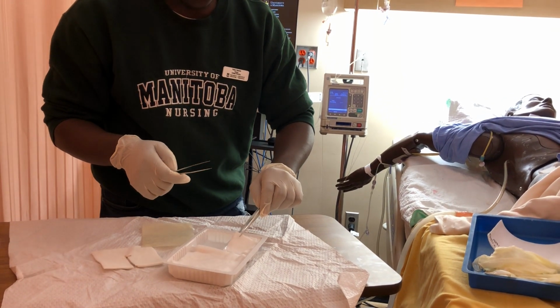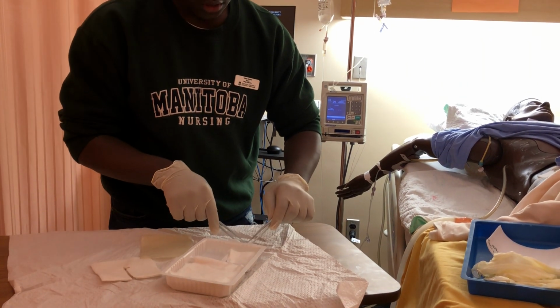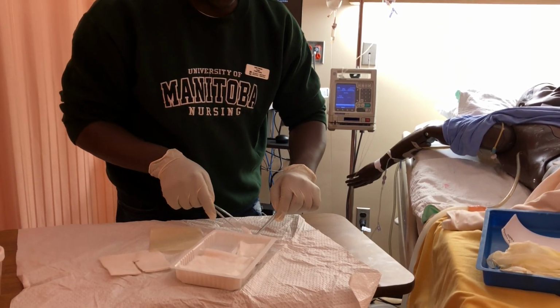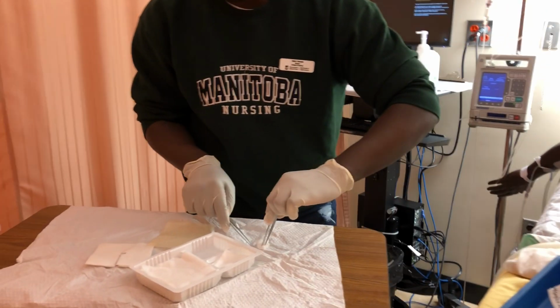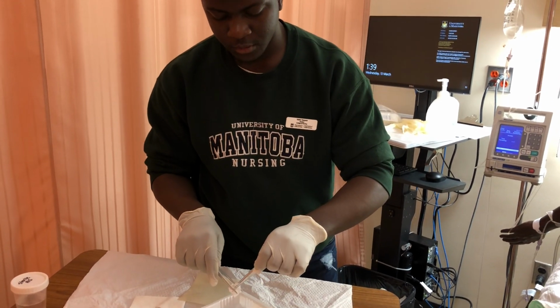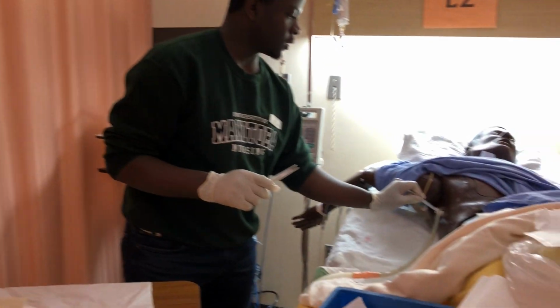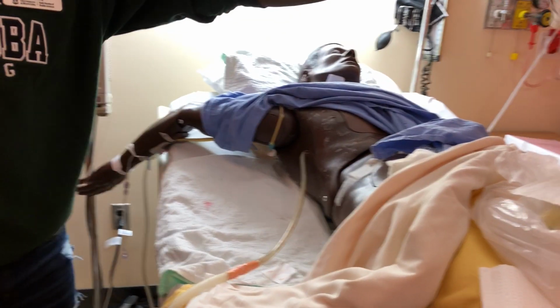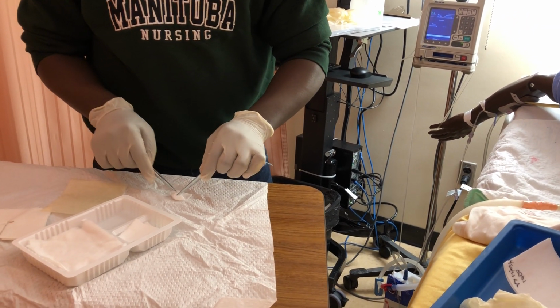Inside of the 1-inch border, I can use 2x2s to start cleaning around the chest tube. I don't want the center part dirty, so I want to maintain sterility in the center. I'm going to add my normal saline. So I use a 2x2, dip that in normal saline, strain it, and I'll clean around the dressing once and just put that in the garbage. Now I'm just going to add more 2x2s.